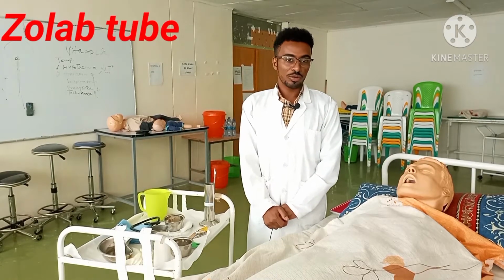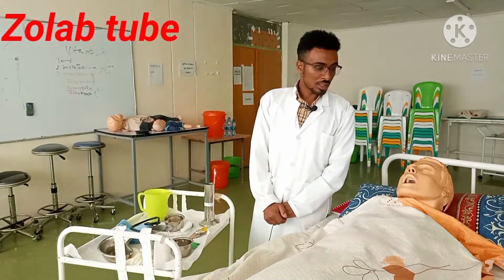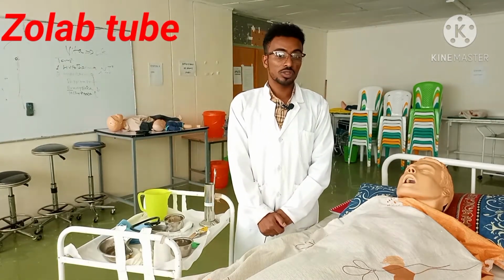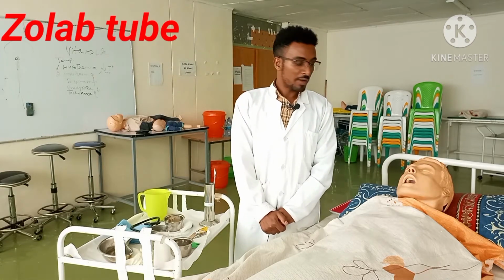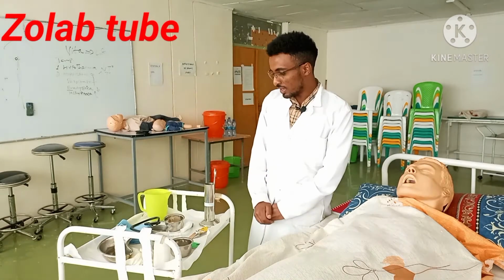Today I am going to show you how to insert a nasogastric tube for a patient. Nasogastric tube insertion is the insertion of a plastic tube into the nostril, down the esophagus, into the stomach. It may have different purposes, maybe for decompression of abdominal distension, for lavage, as well as for gavage.